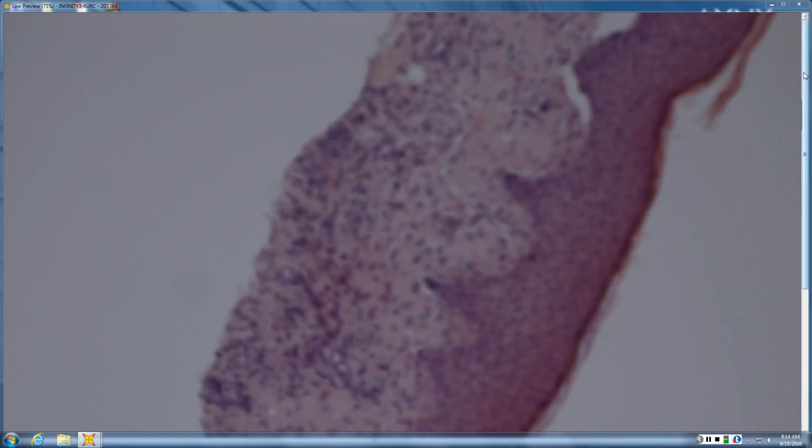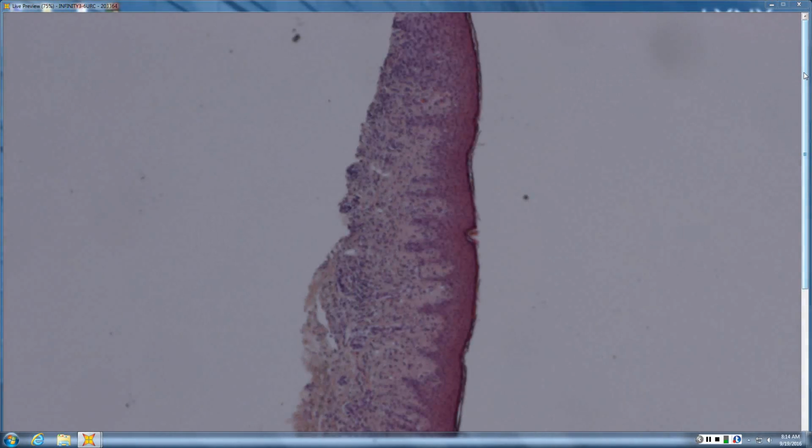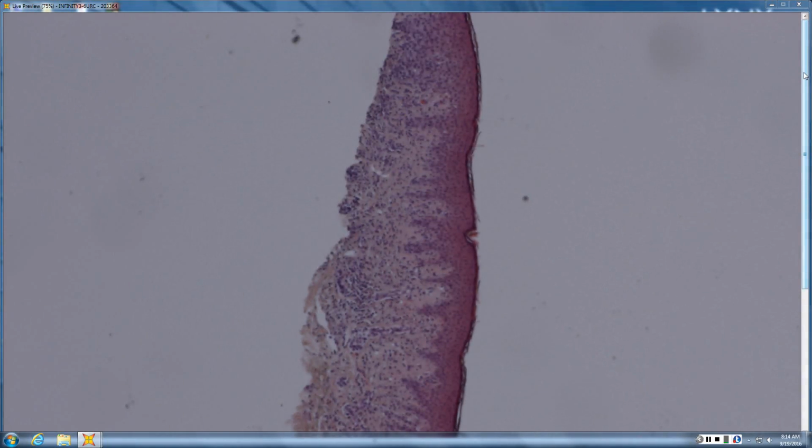I think that came up at Grand Rounds, that discussion. And the key is distinguishing eruption of lymphocyte recovery, which is benign, from graft versus host, which is not benign. And the keys would be the grade of the infiltrate. This never has much going on at the junction. And the lack of any GI involvement, lack of liver involvement.